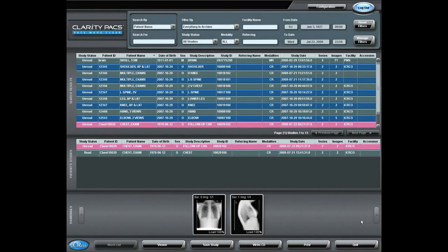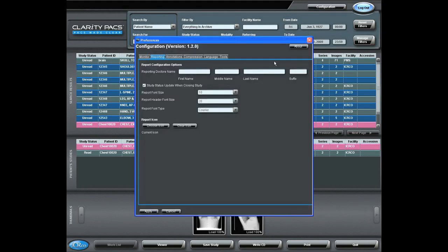Now, I would like to demonstrate Clarity's Patient Reporting System. First, I'll access the Configuration button and the Reportings tab and indicate the name of the physician who will be making the reports.